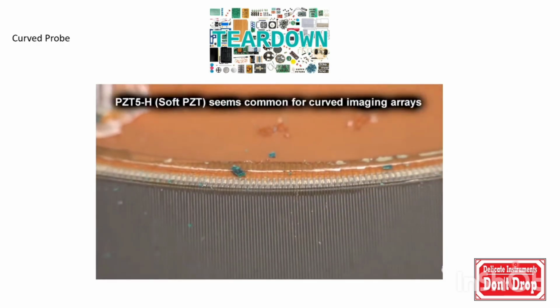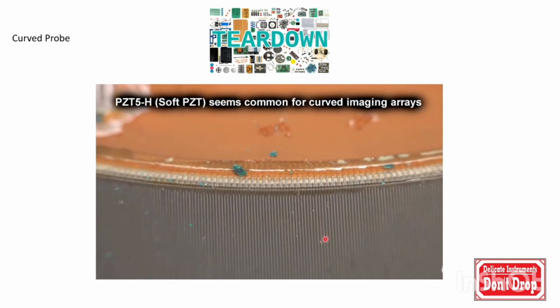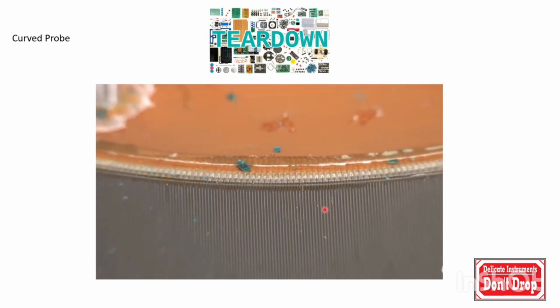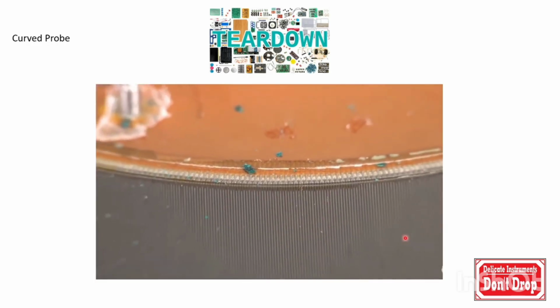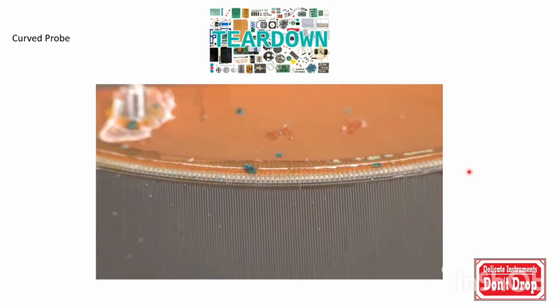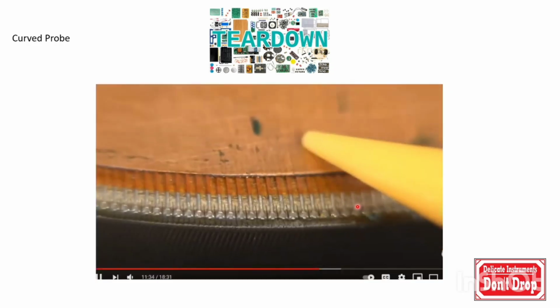So this is very delicate. When you drop it, this face is very much exposed. If it falls on the ground and hits this part, these piezoelectric crystals will be damaged, and you will end up damaging your probe. And mind you, the probes are very costly. So be careful when handling probes and not to drop them.